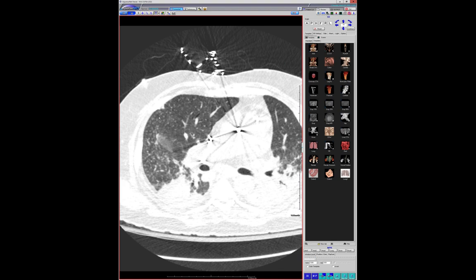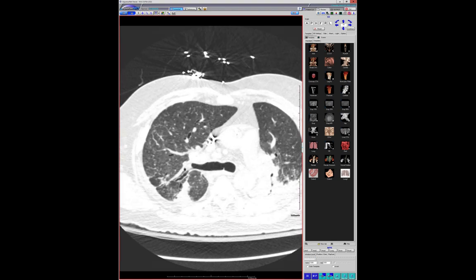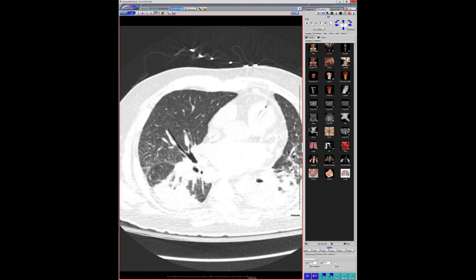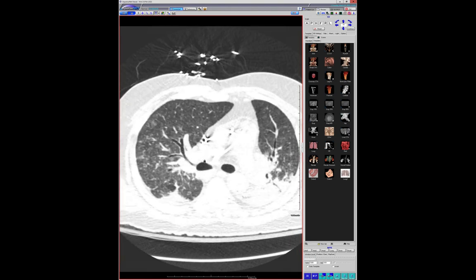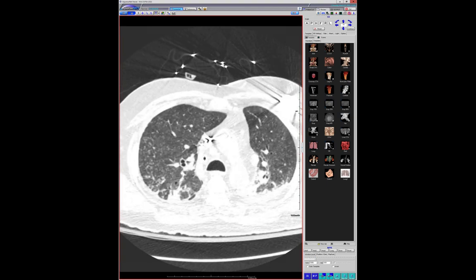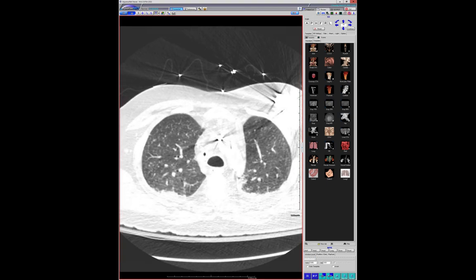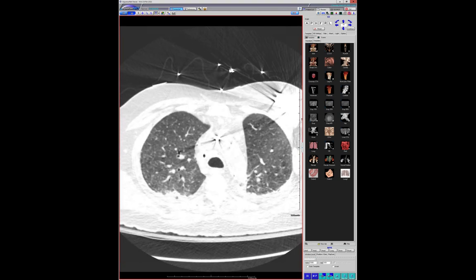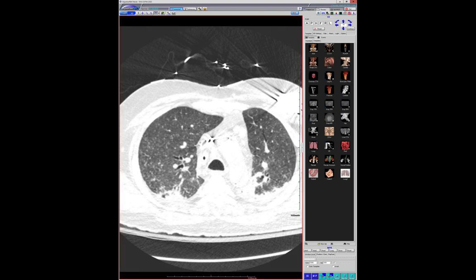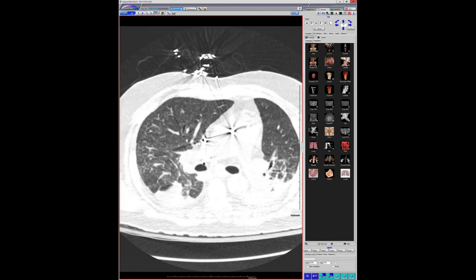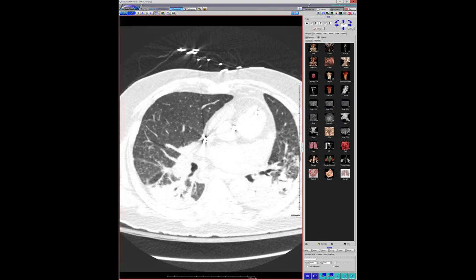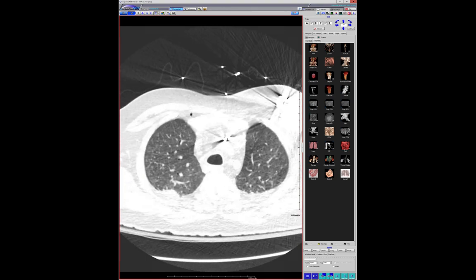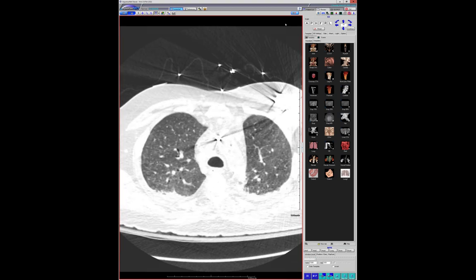I don't see clear seeding. There's a lot of sparing of the subpleural, so predominantly centrilobular. This guy was immunocompromised and had an aspiration pneumonia, but on top of that this was a strong Strongyloides infection — one of those disseminated Strongyloides infections where they lodge in the pulmonary arterioles. I don't love cases where I can't make the diagnosis without history, but this was another case of Strongyloides.